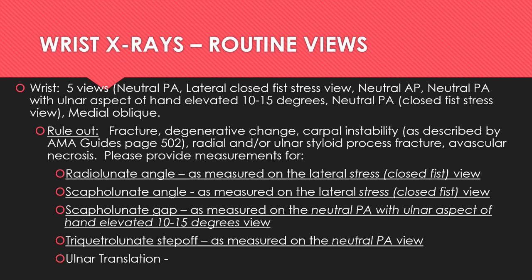Number 1, that the X-ray technician is familiar with and can reproduce these views. And number 2, that the X-ray technician has the means to label these views on the image itself, so that you and any other party can readily identify which view you're looking at.